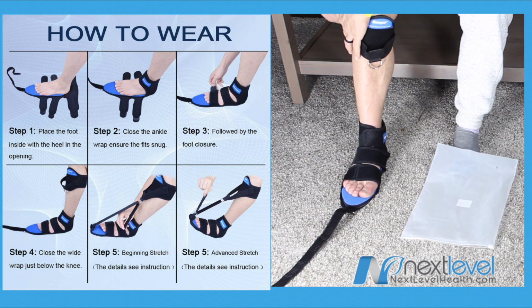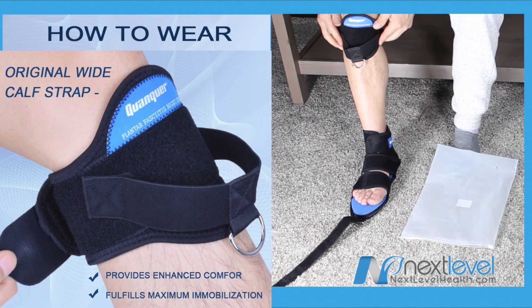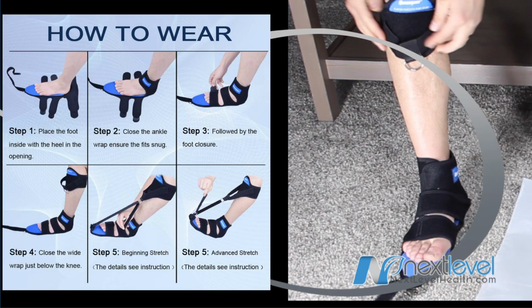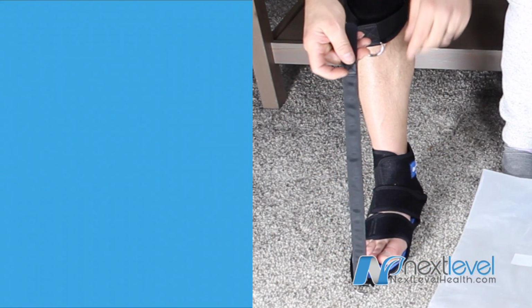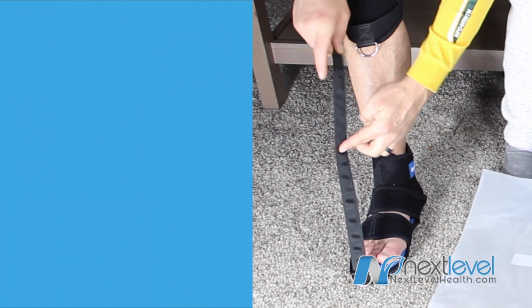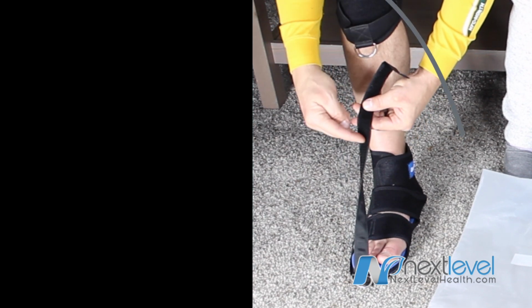So then you're going to grab the calf strap. It's that second strap, and you're going to secure that above your calf. And so secure the calf strap, and you'll notice the metal ring attached to the top of it. So there's a couple ways to secure this strap. I want you to notice the strap, though. It has two different sides. There's a smooth side, and there's that fuzzy side for the Velcro to strap.